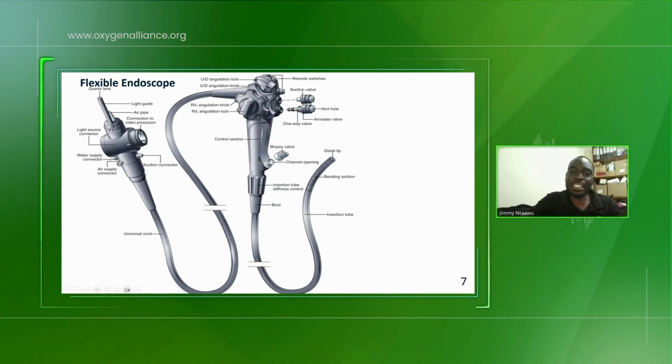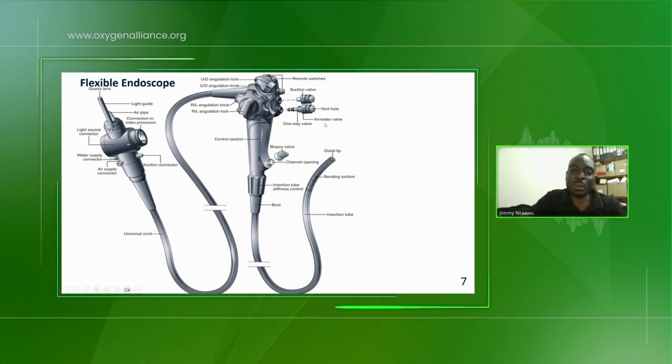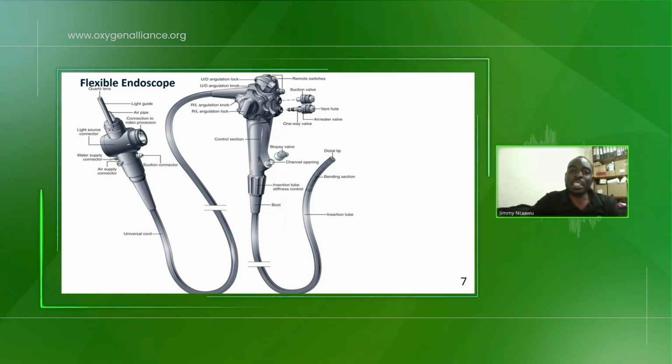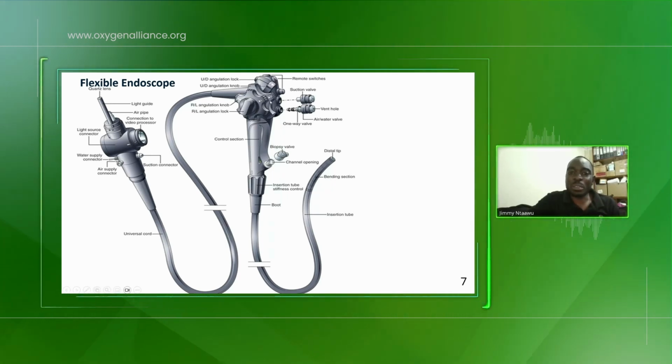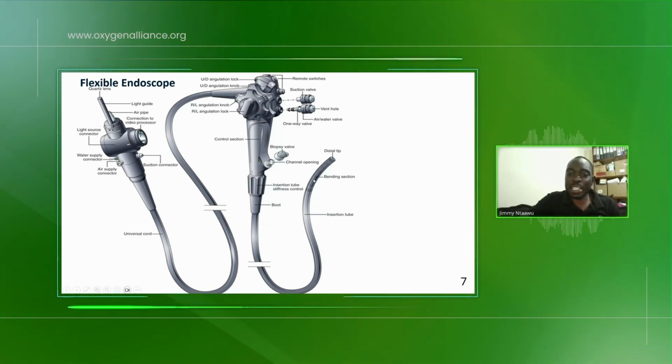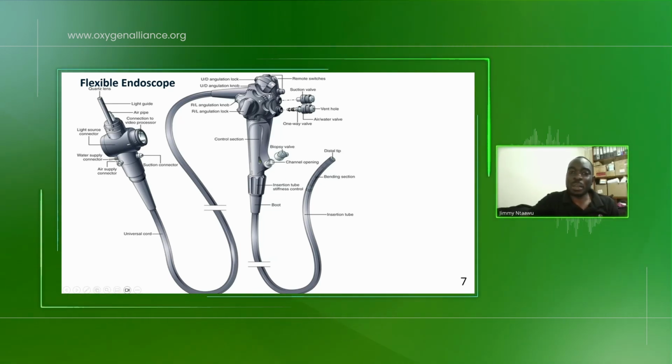I just turn the knob. What happens is what we call snapping in endoscopy. You've snapped the scope in that you've forced it to turn until the knobs are disconnected from the wires that are controlling the bending section. So the scope has snapped.